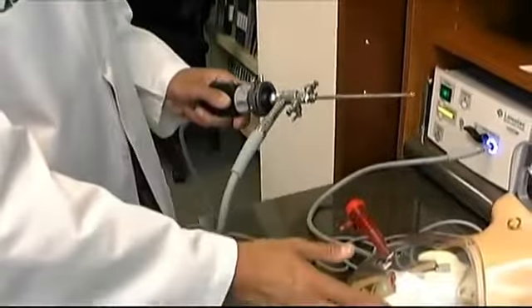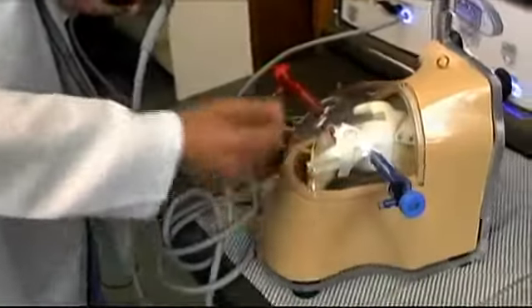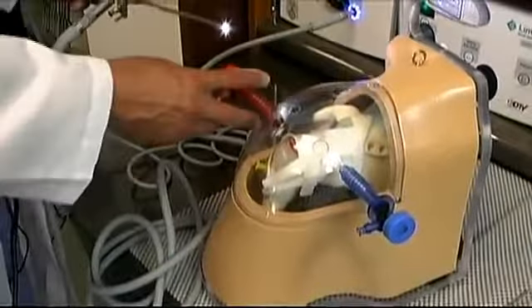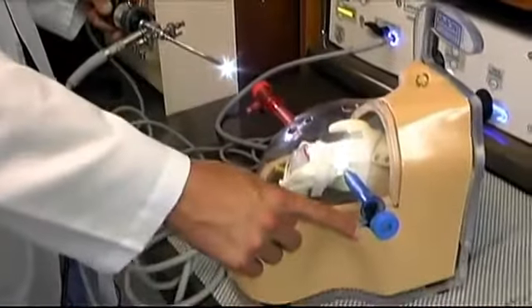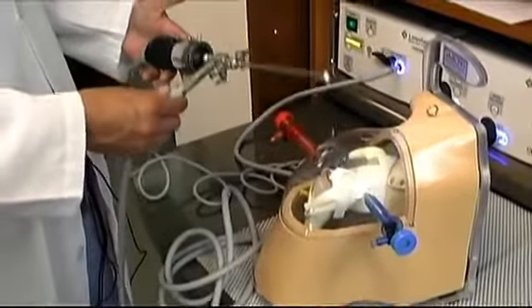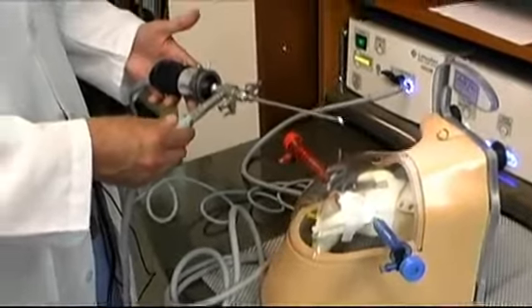Now, this model right here is a shoulder model. The head would be over here, the shoulder is to the side. These represent cannulas that we place to hold our place within the shoulder joint, such that we can place the cannula or the camera down one of the cannulas or any of the other cannulas. So I'm going to give you a little introduction about how this actually works to show us the inside of a joint and enable us to not only do surgery, but practice surgery and teach surgery at the same time.